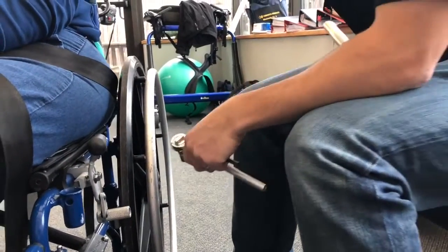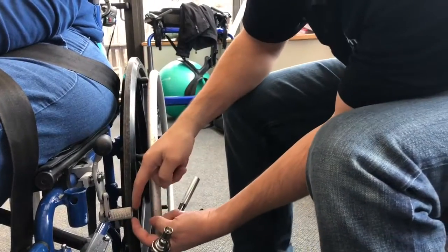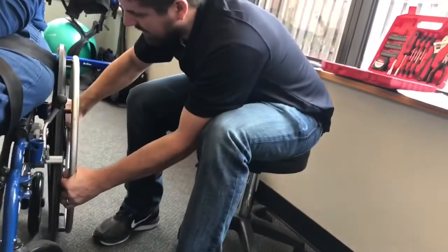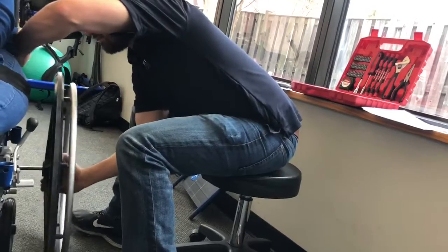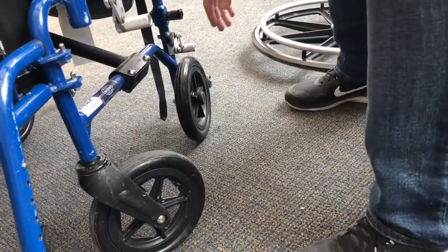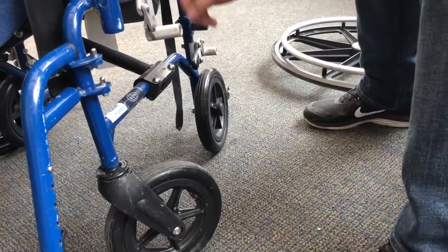this isn't locking well, that we're still getting movement here, and that this isn't centered right. So the way that we're going to adjust that, and actually this particular chair has a quick release, it's a hybrid chair, so I'm able to actually take this wheel completely off of the chair. And you can see it's a hybrid transport chair, so it has another small wheel back here. We're not going to worry about this brake because she doesn't really use this chair as a transport chair. But what we're going to be working on is this right here.